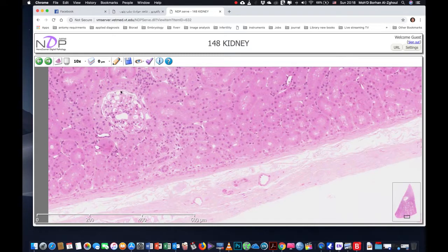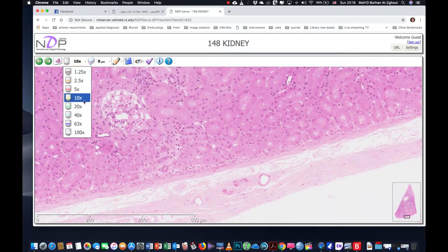This is the space. And this here is the cell, the simple squamous epithelium that forms the parietal wall of the Bowman's capsule. Inside here consists of the blood capillaries, and the cells that are found here, they are the modified podocytes. I want to increase the magnification.